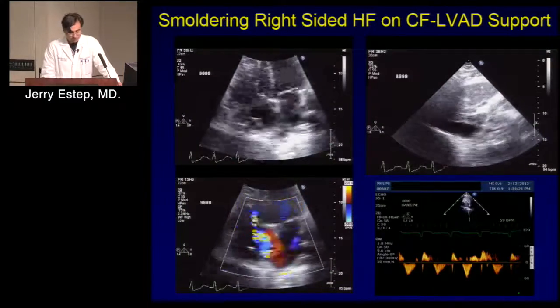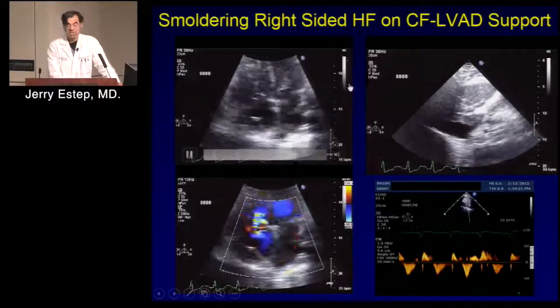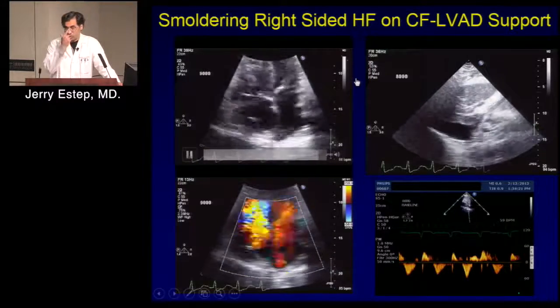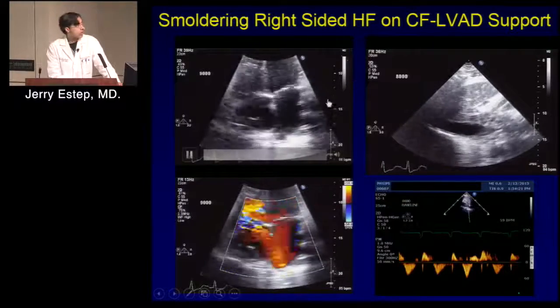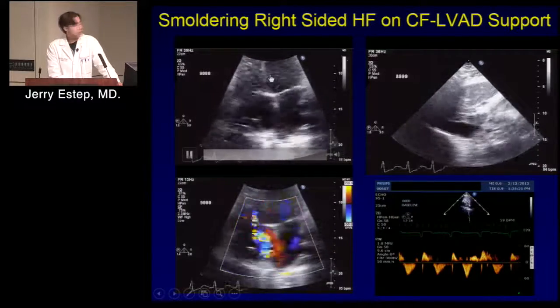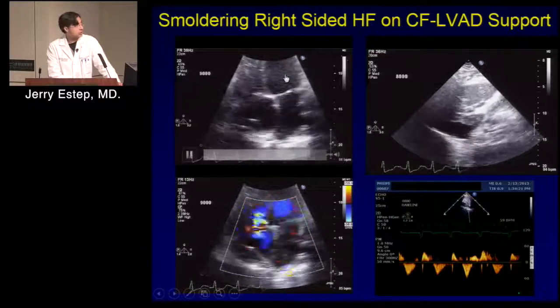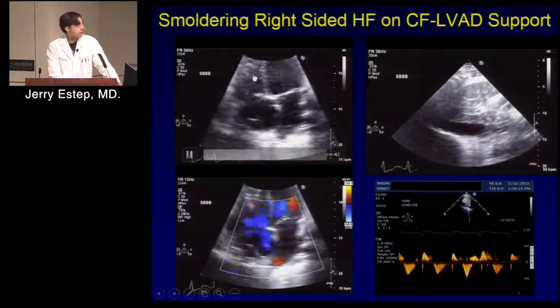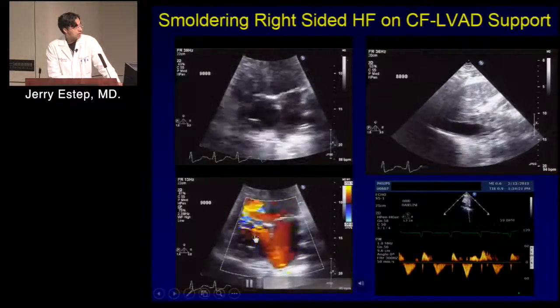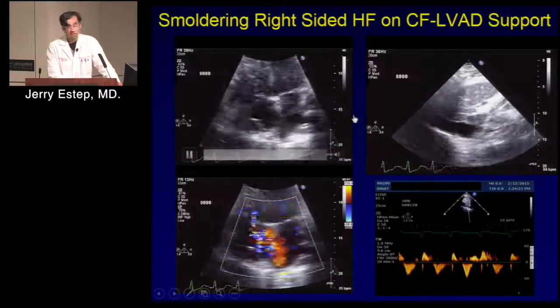Now, this particular patient was more than several months out, and this concept of late RV failure on an LVAD, we're learning more about in terms of prevalence and predictors. But you can certainly appreciate the interventricular septal motion, and it's really with LV contraction where LV pressure is highest to then get the septum over to the RV, bowing of the interatrial septum to the left, significant TR, high right atrial pressures, both clinically and by echo, where we had to get this patient to transplant.